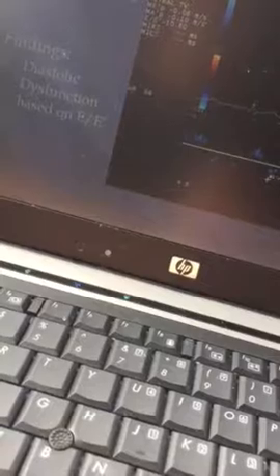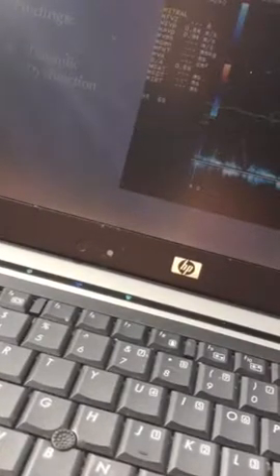On the mitral valve pulse wave, we get an E to A ratio of 0.89, which is normal. We're going to call that normal. Well, it's actually on the border of diastolic dysfunction. So we'll call it diastolic dysfunction. It is just over threshold. On the E prime values for the tissue Doppler, we saw, again, diastolic dysfunction based on those E prime values.